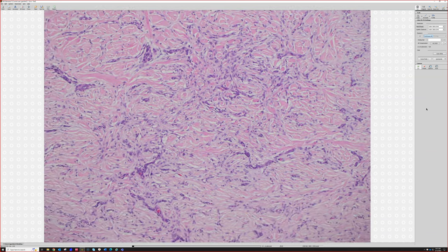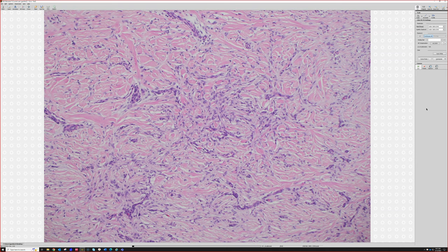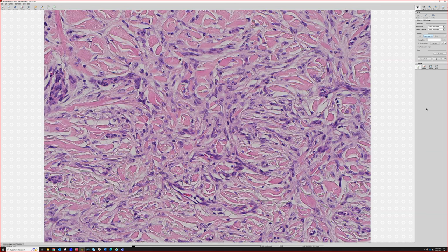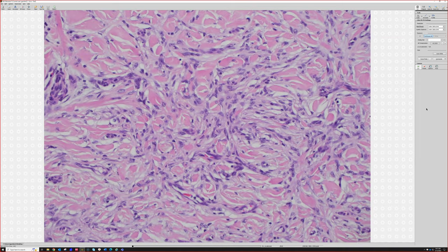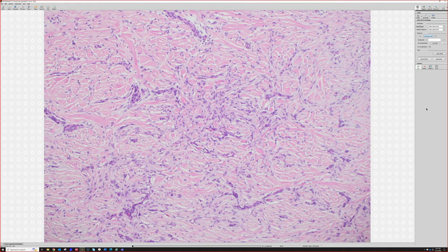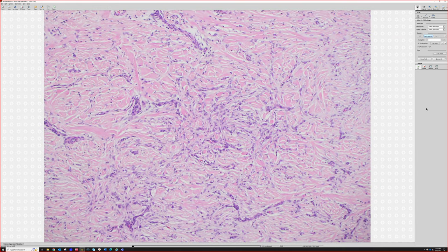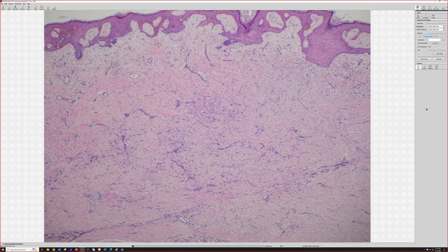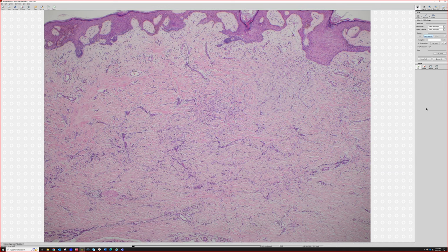In the middle, though, the spindle cells start looking more classic here, and we've got entrapment of little collagen bundles, little pink collagen bundles wrapped around by the spindle cells. And the spindle cells can be bland and thin. They can also be plump and a little atypical. The cytology can run the range of features in dermatofibromas, and you can have very hypocellular sclerotic ones, and then all the way up to really big cellular deep ones. Dermatofibroma has a huge wide spectrum, okay?